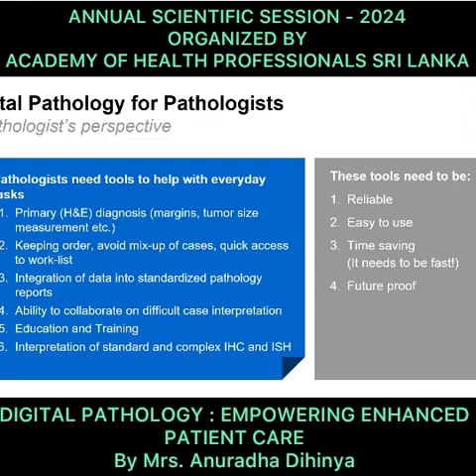Same thing, it allows you to collaborate on difficult cases for interpretation. When I'm talking about difficult case interpretation, sometimes you require a peer review from your seniors also. You can transfer those cases digitally in a fraction of a second. Whomever you're sharing those cases with, the pathologist can discuss those cases, because the cases have been shared digitally to them, and those difficult cases can be reported out.